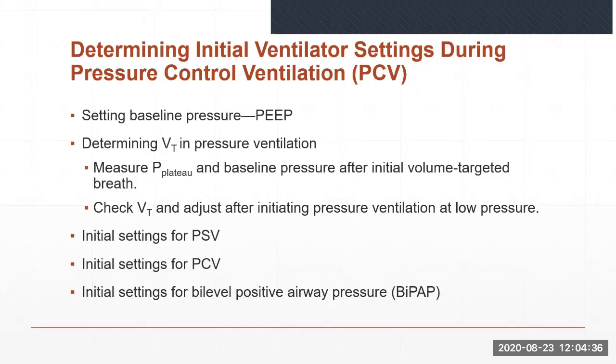With pressure targeted breath delivery, rapid initial flows may cause frictional forces or shearing between adjacent alveoli with differing lung inflation characteristics. In addition, tidal volume varies as lung characteristics change. There currently are no definitive studies that have demonstrated a clear advantage of one method over the other.